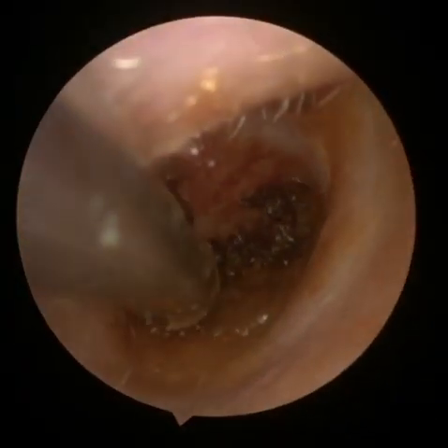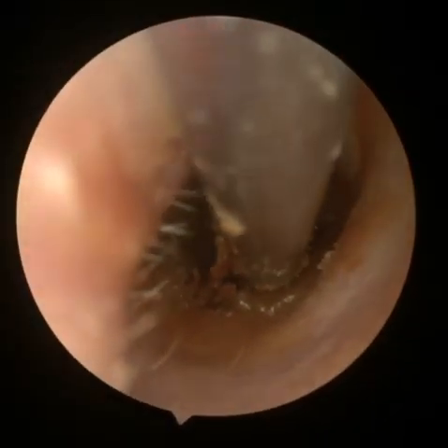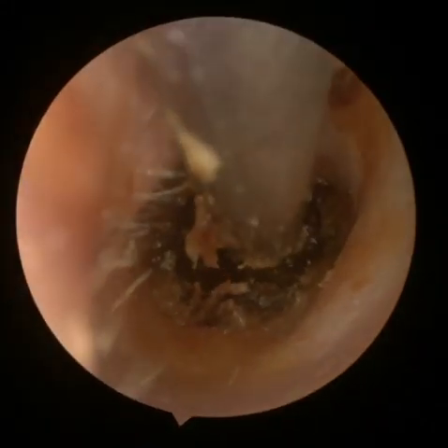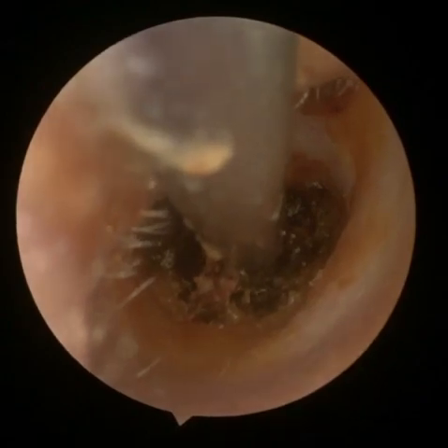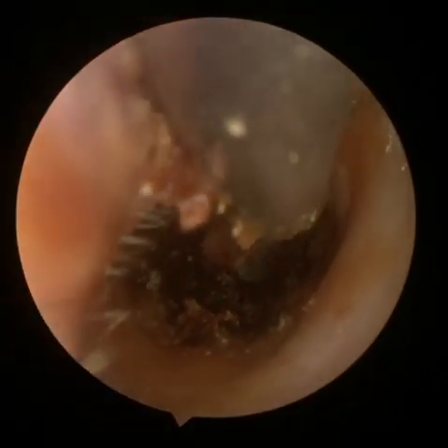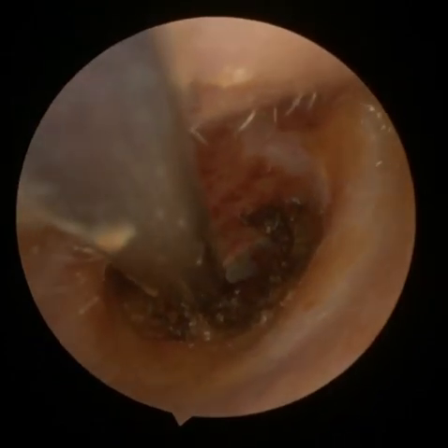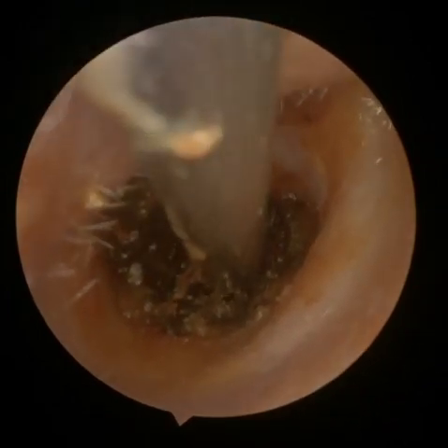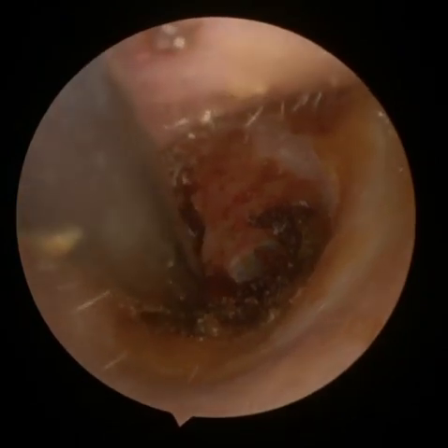Again, you can see this incredibly sticky wax as we take bits and pieces away. There you see the first part of that membrane — the eardrum just been exposed. This sticky wax was completely on that drum, taking away its compliance. Again, you have to be very, very careful; it's quite deeply impacted wax.